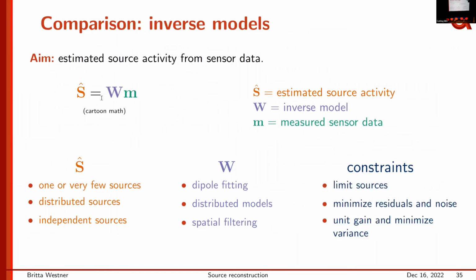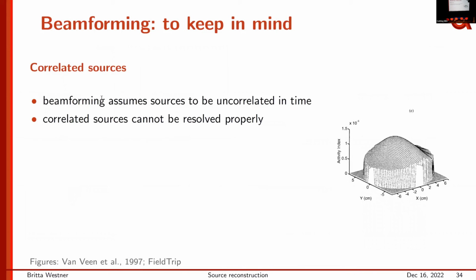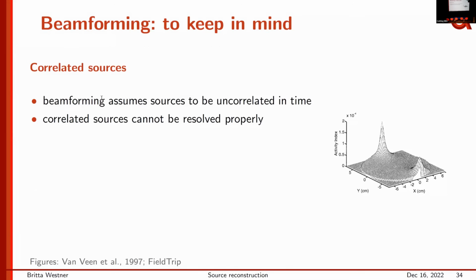I'm not sure I understood that acoustically, but you can see here in this example, it blurs. I mean, this is an extreme example. This is, I think, when they are perfectly correlated, so correlation of 1. But here you can see it starts to blur between those 2 sources.